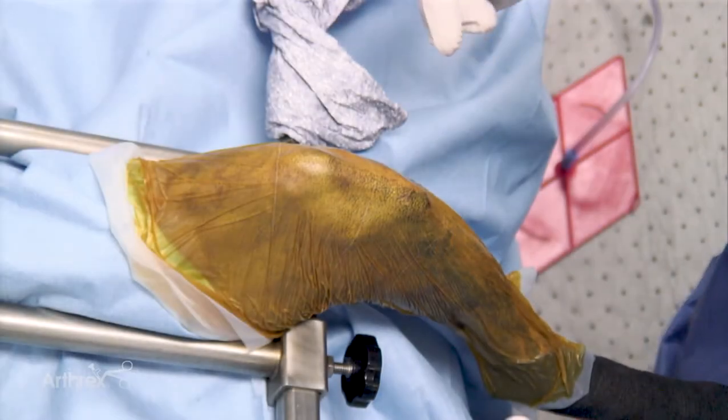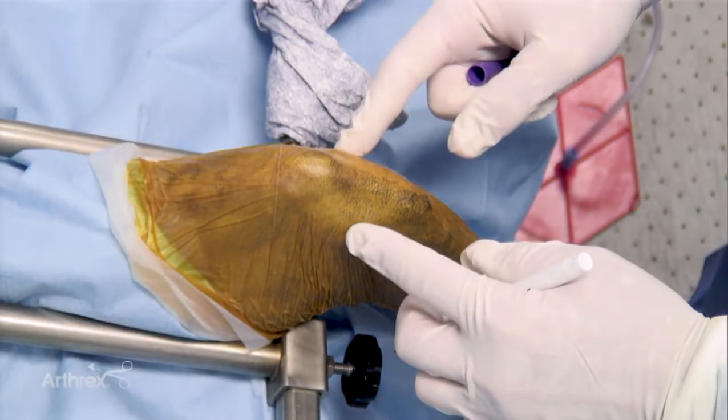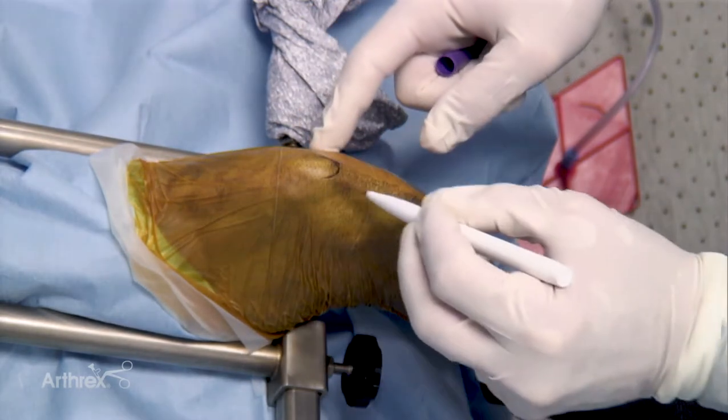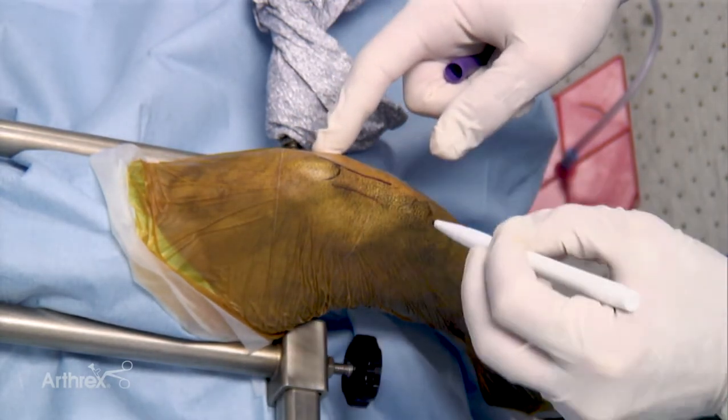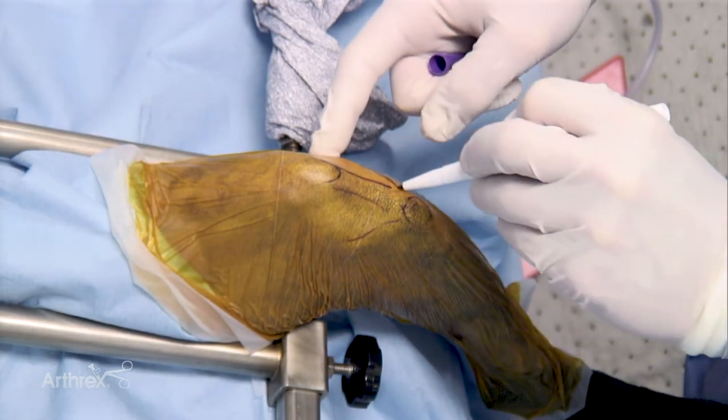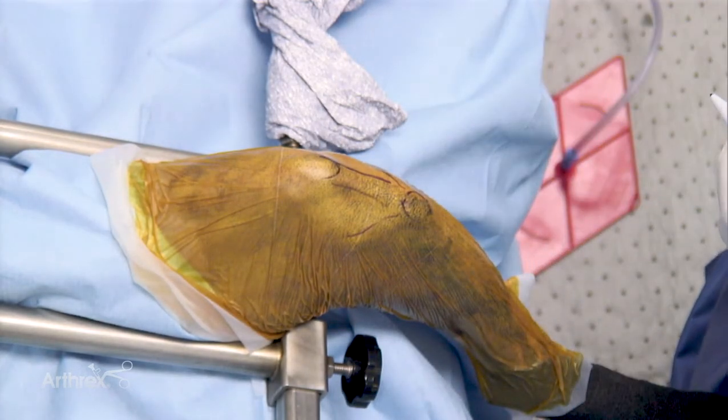Once positioned, it is important to identify the anatomy prior to commencing the arthroscopy. The patella, the straight patella tendon, the tibial crest, the medial joint line, and the lateral joint line are all important structures that must be clearly identified.